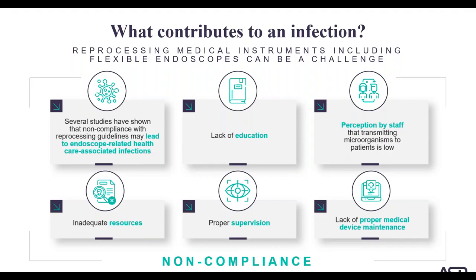So looking at the slide, why might these steps have occurred? Well, possibly because of lack of education. Are the people who are doing the process, are they trained? Do they have competencies? Are those competencies being kept up? Staff's perception of the risk being low for transmitting microorganisms. Maybe you've heard this once or twice. We've always done it this way, and we haven't had an issue.